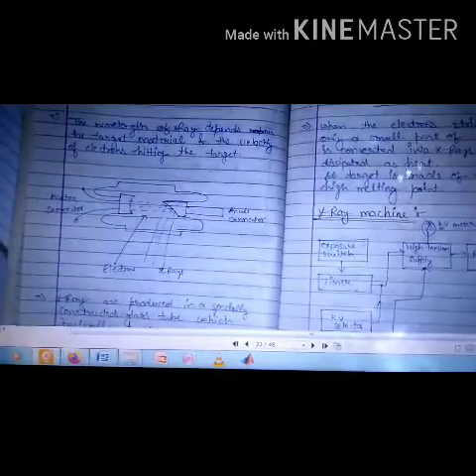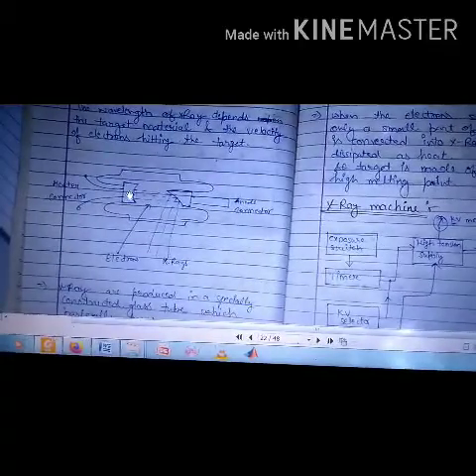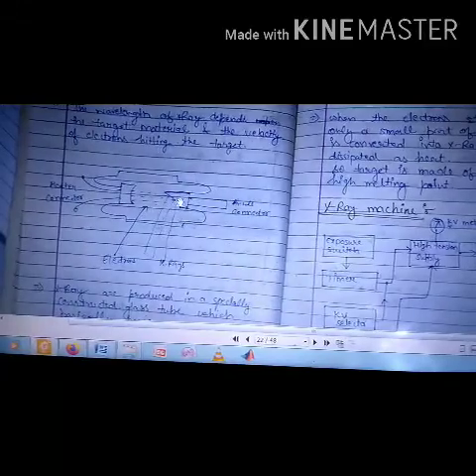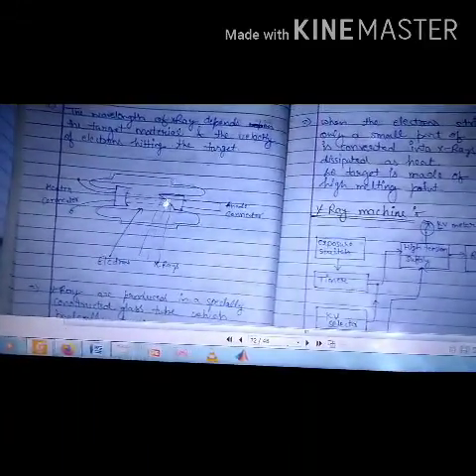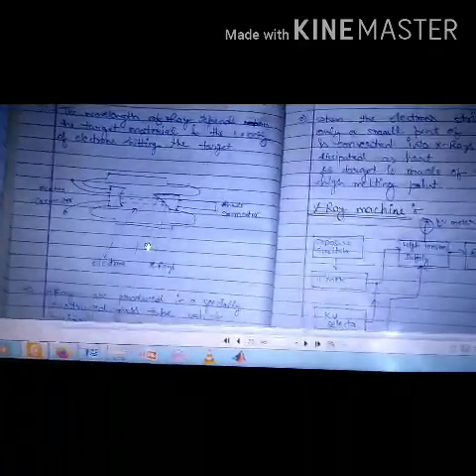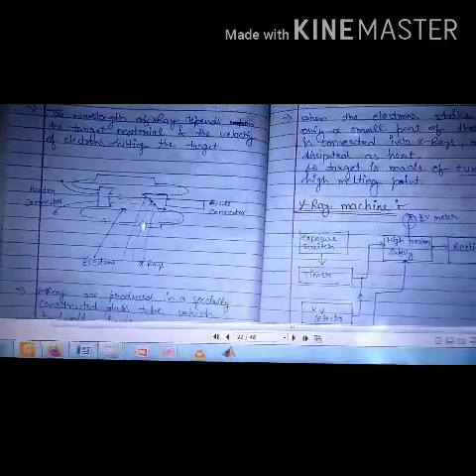This is a very rough diagram showing how X-rays can be produced. Here is a heater connector, and this is a cathode part with a heater, and then electron beams are produced which hit a predefined anode. This is the target, and when these electron beams hit this target, X-rays are produced in a particular direction. It is the cut of the anode also which diverts the X-rays in a particular direction.